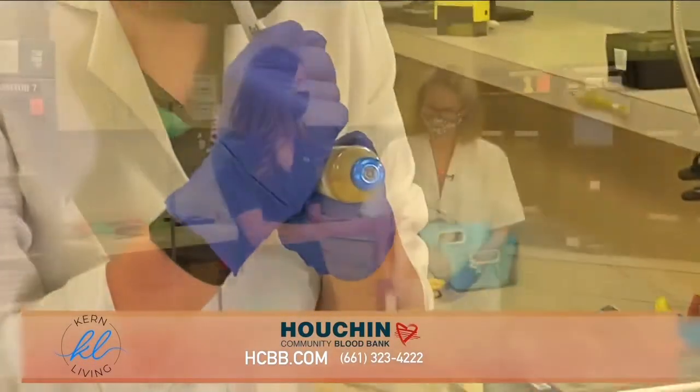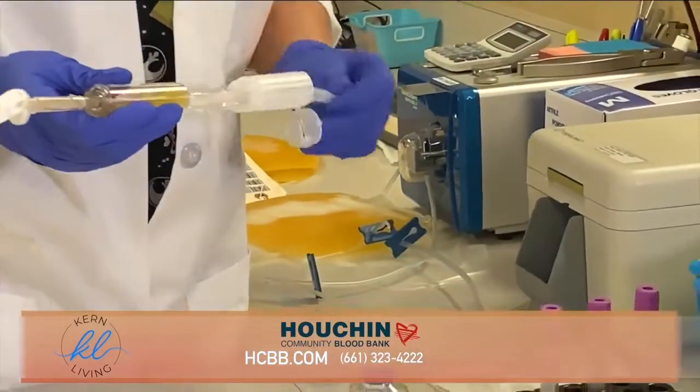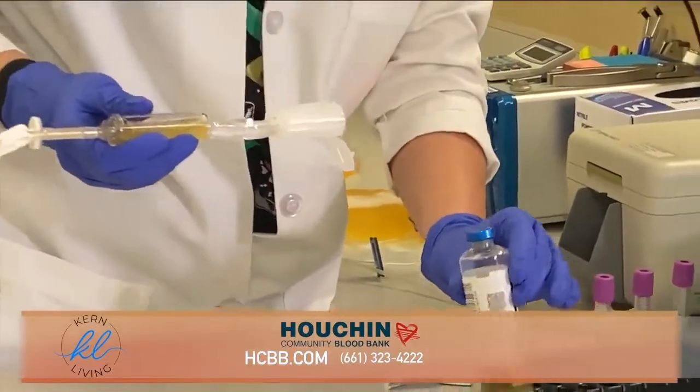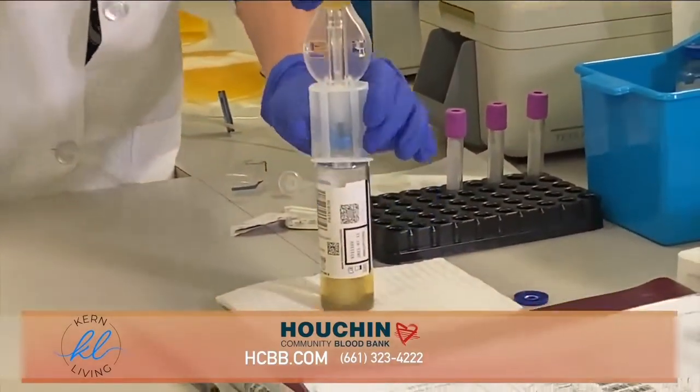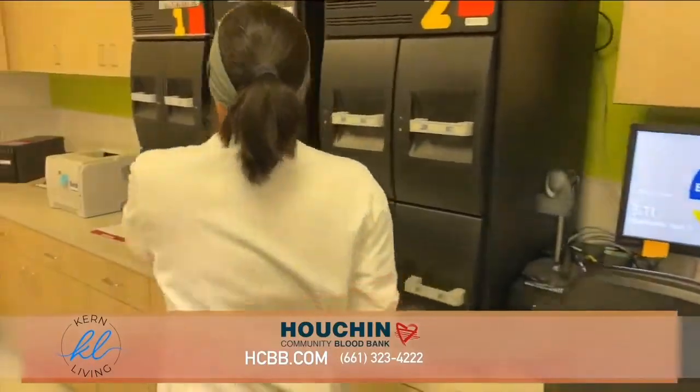Okay, so what is she doing over here? Yvonne is about ready to do a culture. What she's going to do is sterilize the bottle with an alcohol prep. And so she's going to obtain a sample and inject it into the bottle, and then she'll load the bottle into our machine over here.